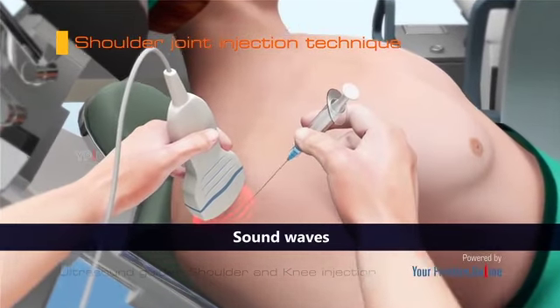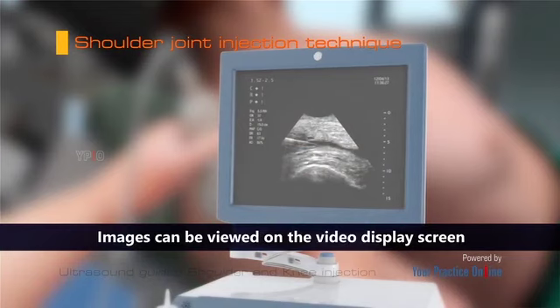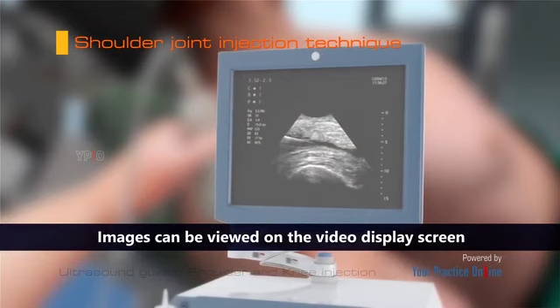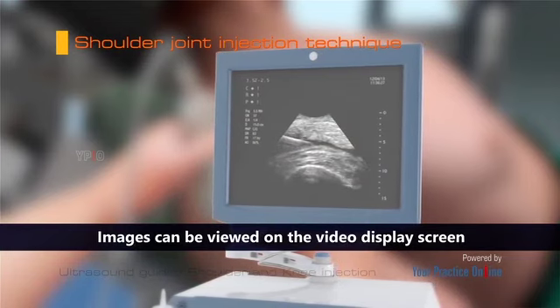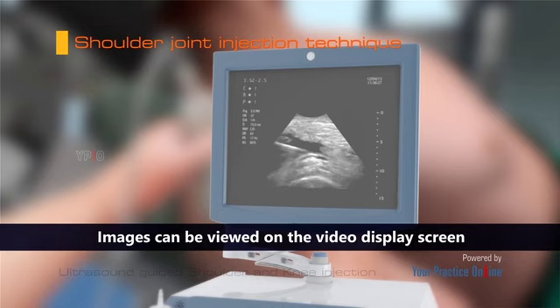The transducer emits sound waves and detects the rebound echoes from the tissue. Images are created from these sound waves and can be viewed on the video display screen attached to the scanner. The waves provide a clear view of the targeted area and help the doctor locate the correct site for injection.